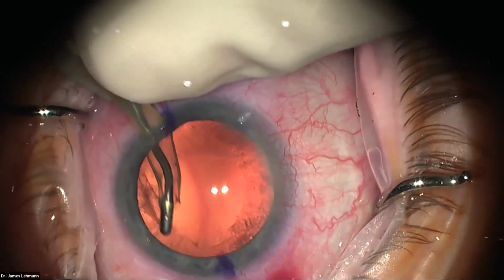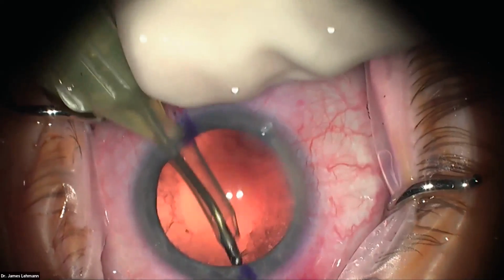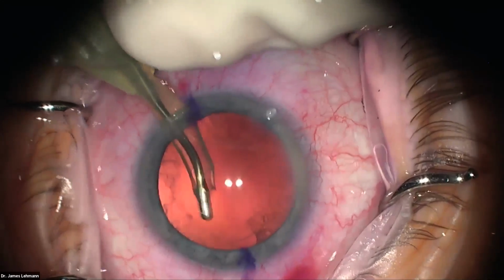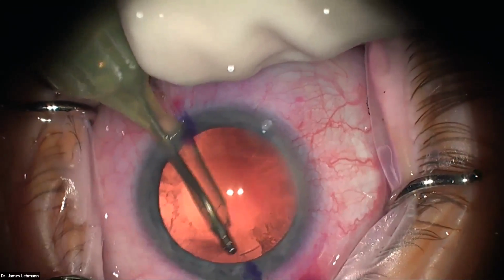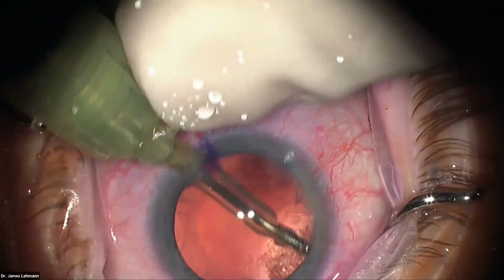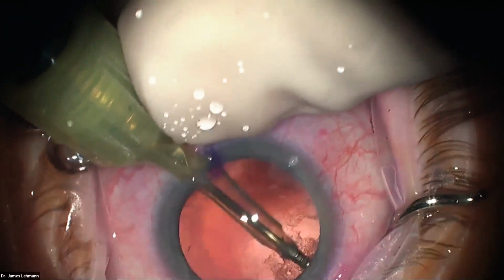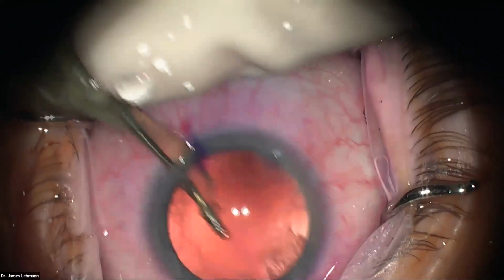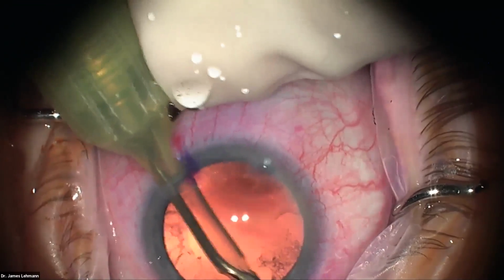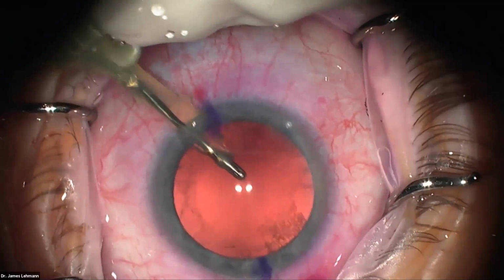So I'm doing gentle cortex removal. I don't want that posterior capsule to trampoline. And this is real stringy fibrotic stuff. It's not like big meaty cortex. So I'm just getting in what I can get without causing too many problems. Let's see, get some of that. I'm using very moderate vacuum here because if I use too much, it would just tear off. So that's pretty good. I'm not too concerned about it.